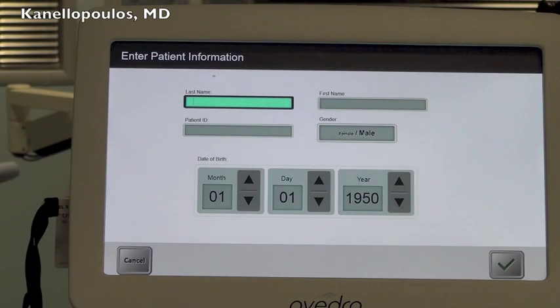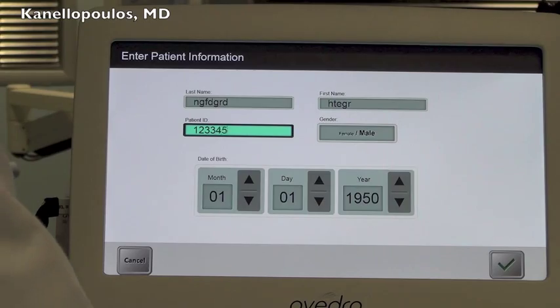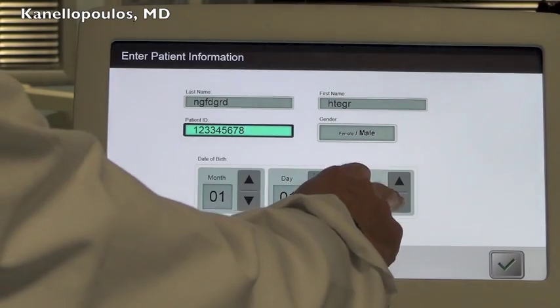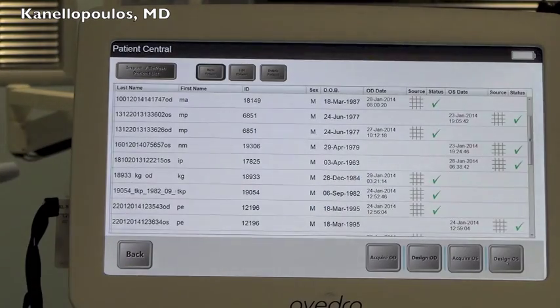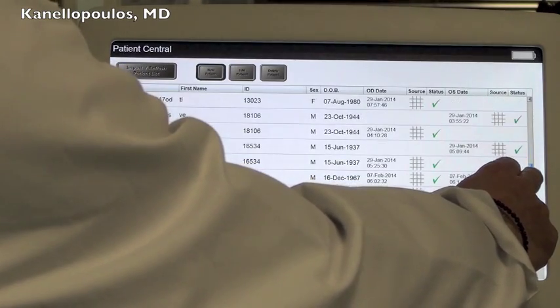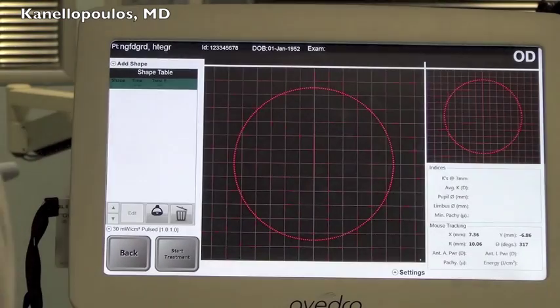We're going to go here now to import data from a new hypothetical patient. So we're going to try and design a normal myopic treatment initially. So patient, the date of birth, usual data similar to what we use in excimer laser.